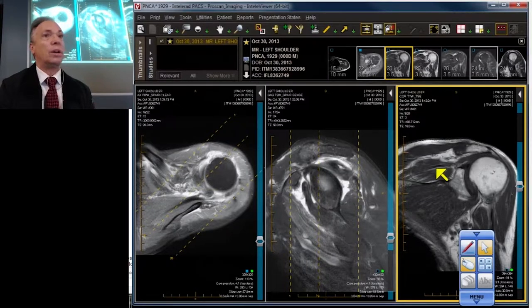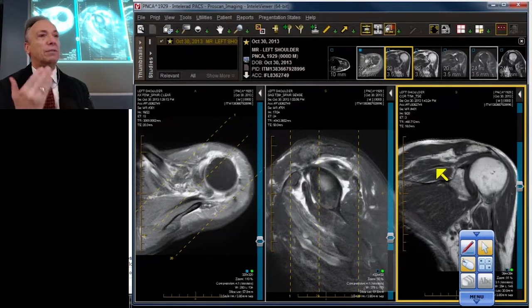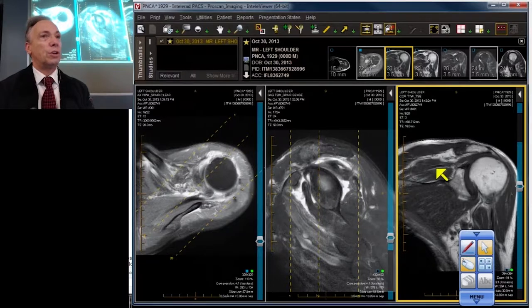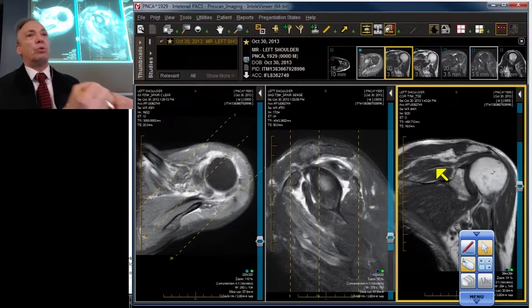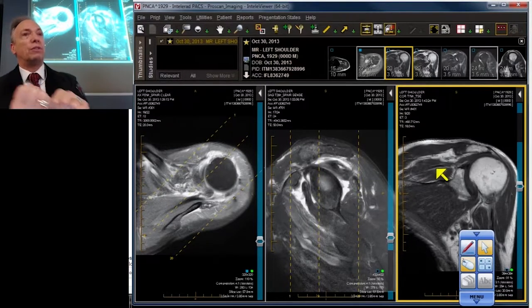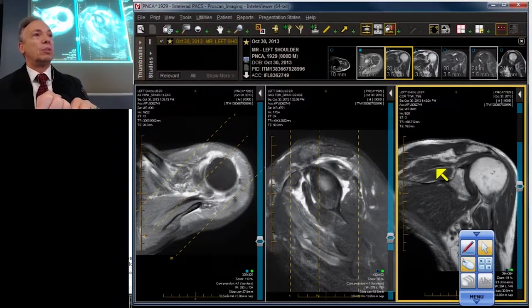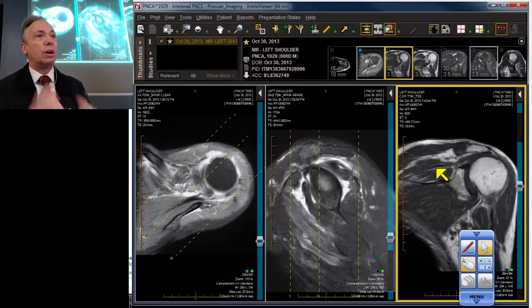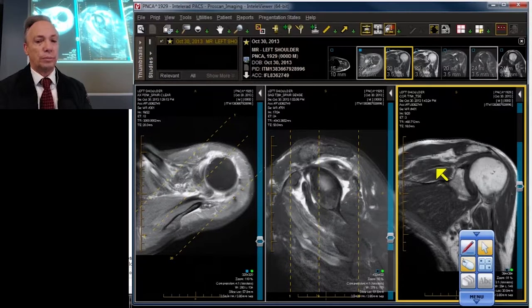Of the two, fatty infiltration is worse. Because if you have fatty infiltration, it's very hard to pull that tendon and muscle over and fix it — you'll probably shred it. So many of those individuals who have severe fatty infiltration are not candidates for surgery.